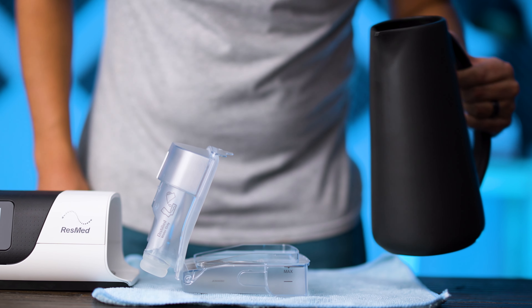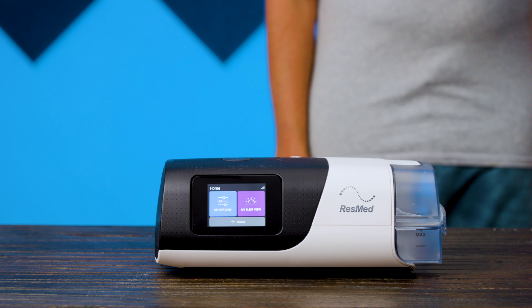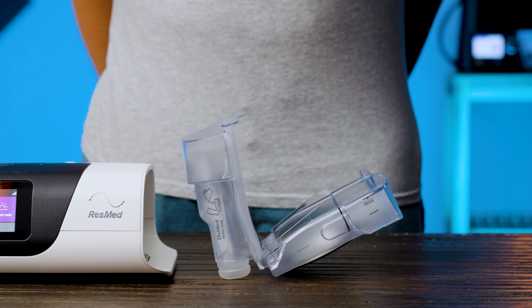The seal slopes down at the back end, meaning it is very easy to spill when you try to close it after filling it to the max line. And don't even think about moving it when the lid is open and it's full. Also, the lid of the chamber is heavy compared to the base, so it's prone to flipping backwards when you try to fill it up as well.